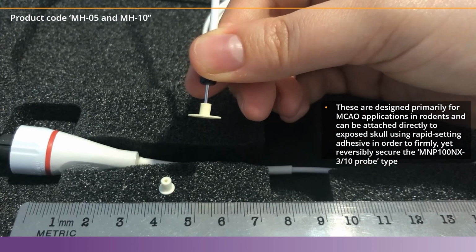The holder can be fixed to the skull using dental cement or other approved adhesives, and the skin can be closed around the collar for chronic studies.